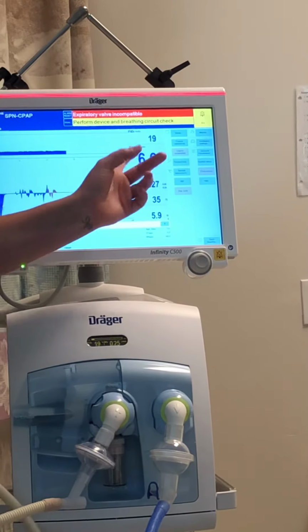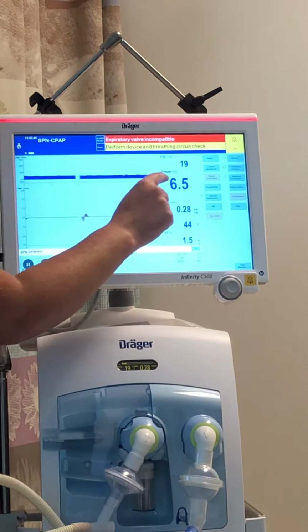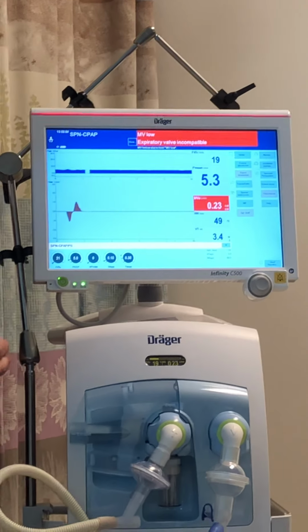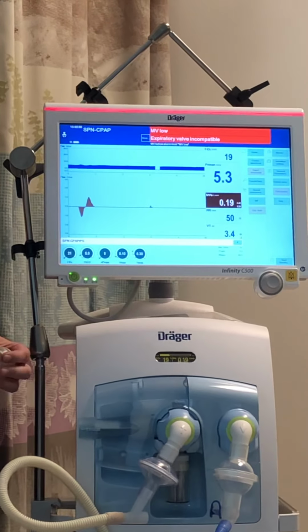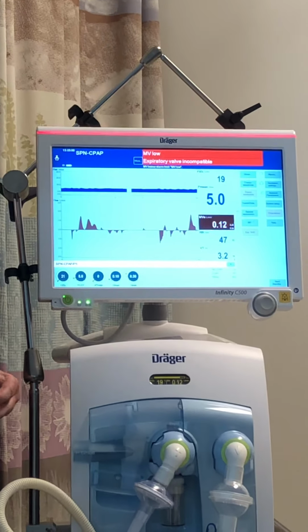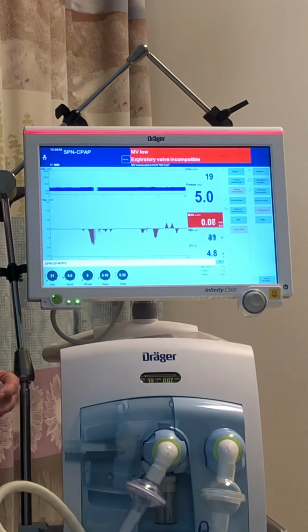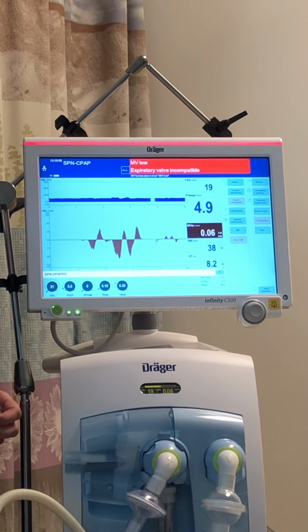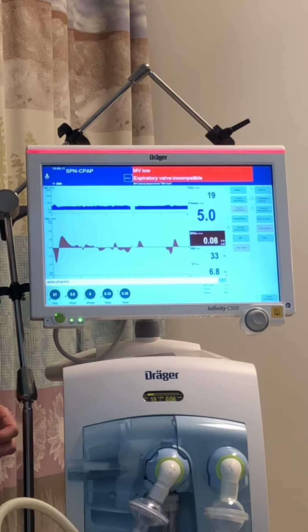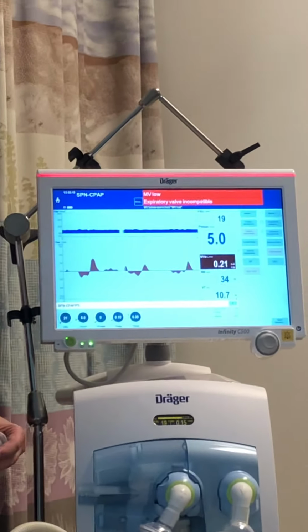So here, it's reading the mean, but you can also see that the PEEP being applied right here on the pressure waveform is at 5. So you're asking what the CPAP was? Yeah, CPAP/PEEP, same thing. Looking at the vent right now, what's the patient's respiratory rate? 39, 38. And what kind of tidal volume is it sensing? It's all kinds of stuff. And CPAP, it's a little trickier.